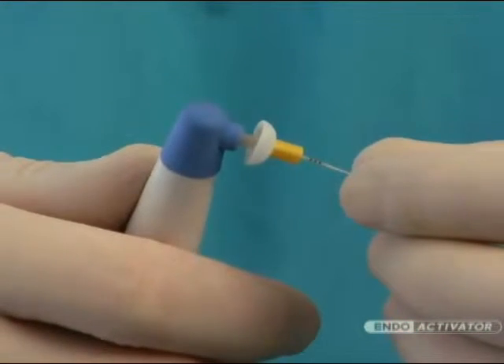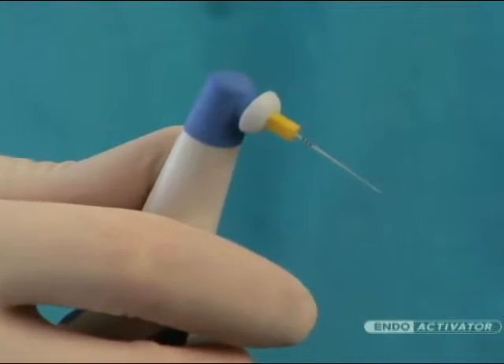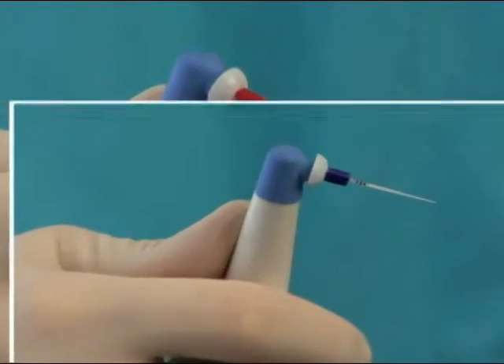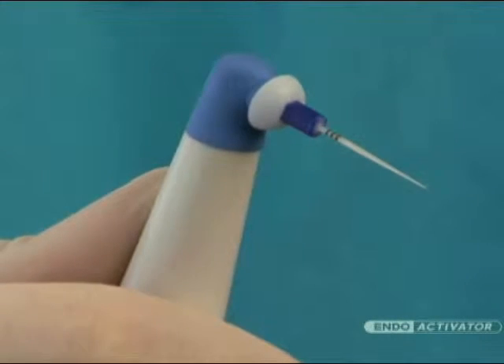The EndoActivator tips have an easy snap-on, snap-off design and are color-coded yellow, red, and blue, corresponding to small, medium, and large sizes, respectively. Importantly, the tips are made from a medical-grade polymer, are strong and flexible, and are 22 millimeters long.